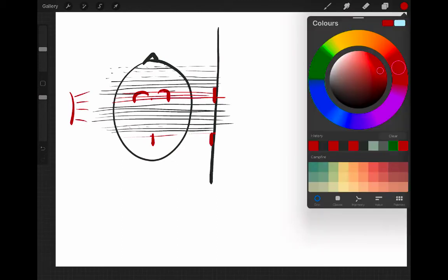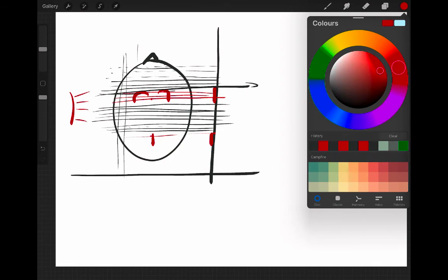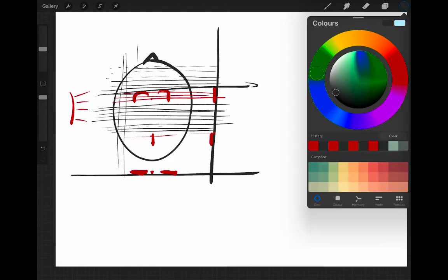Okay, but if I now change the angle in which I do this projection to over here, for example, then you can start seeing that things that were confounded in this particular direction are now not confounded when I go down here, right? So if I just draw the maximum intensity projection here, I'll end up with the shadow due to this thing here, and something there, and something there, okay? And so the clinicians often take these maximum intensity projections at lots of different angles.